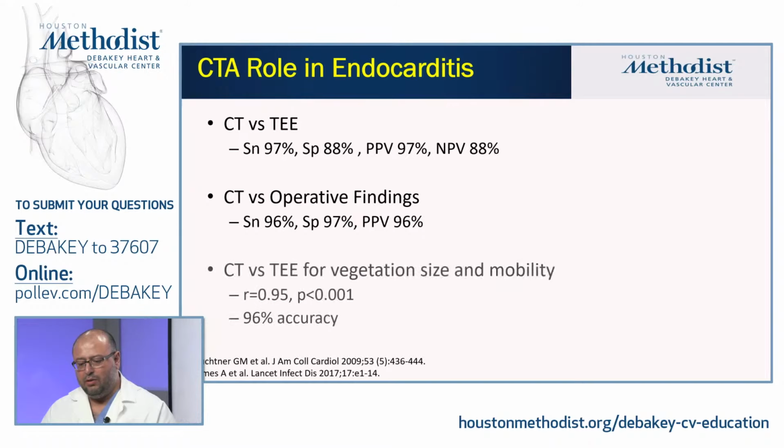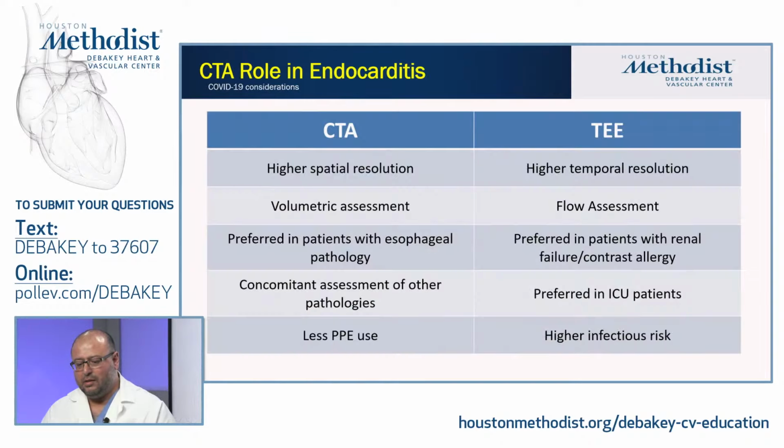And if we're going to use vegetation size and mobility, there is good accuracy. However, again, it depends on the CT system you are using and how good the patient's heart rate is and the other findings. So when do we use CT?